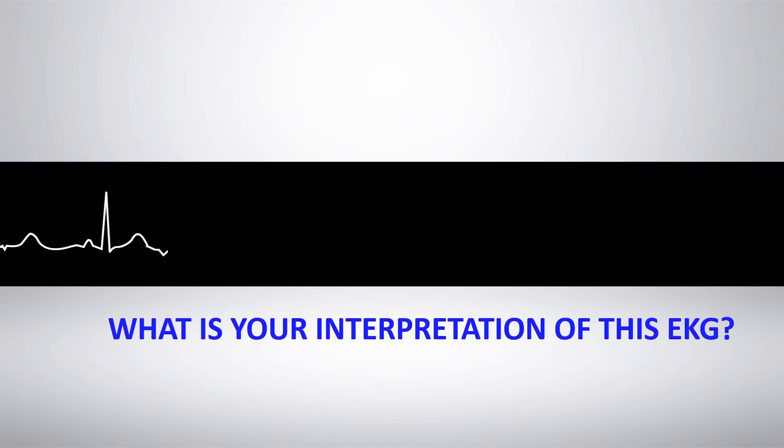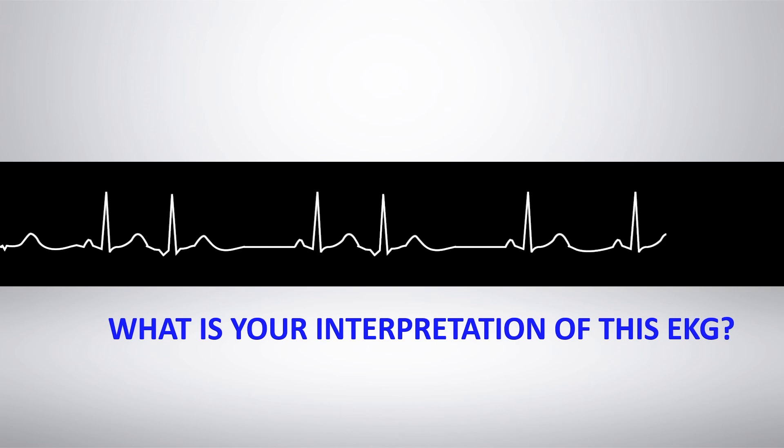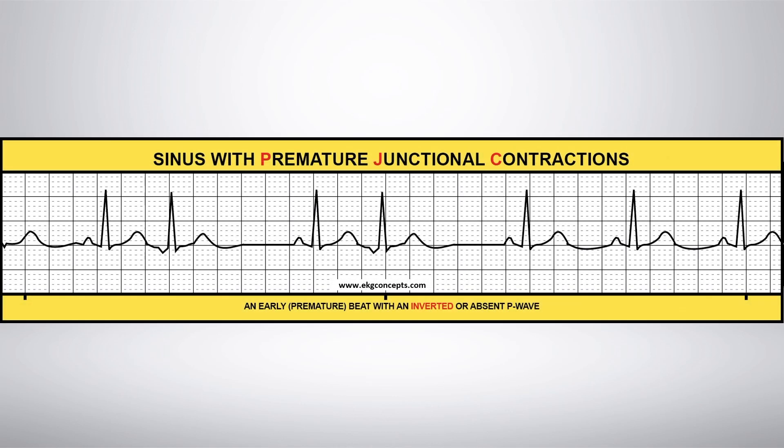What is your interpretation of this EKG rhythm strip? Sinus with premature junctional contractions.